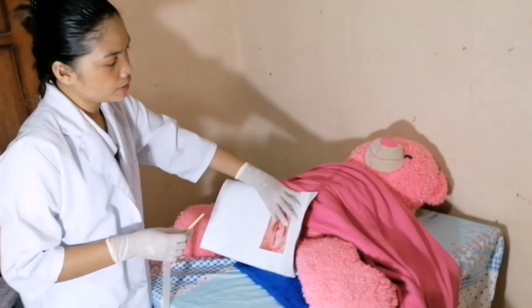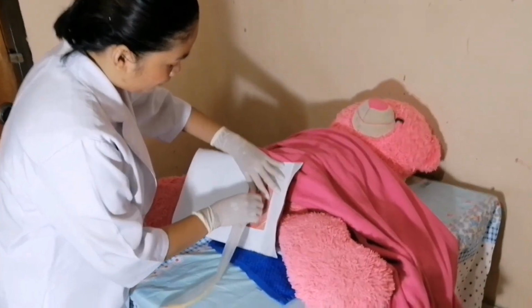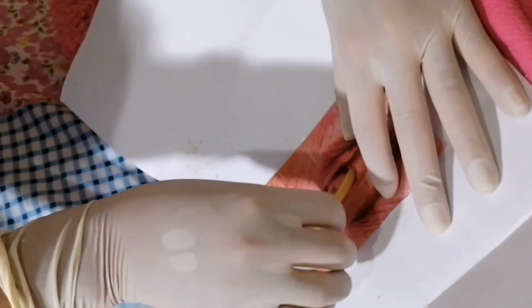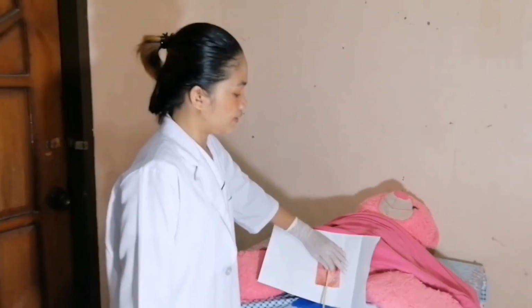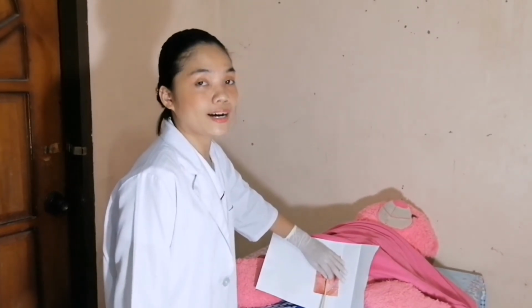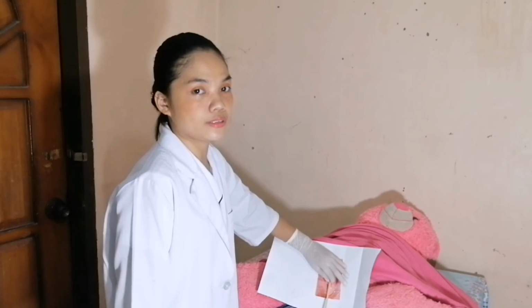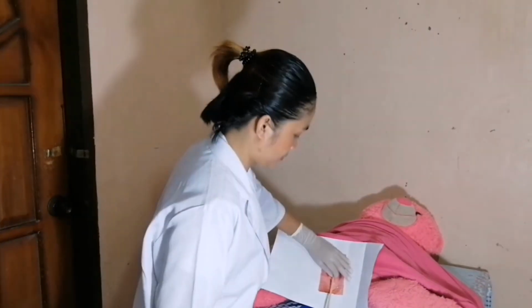Excuse me, ma'am. I'm going to insert the catheter. Please take a deep breath. The next procedure is to hold the catheter securely with your non-dominant hand while the bladder empties. Collect the specimen if required. Continue drainage according to hospital policy.